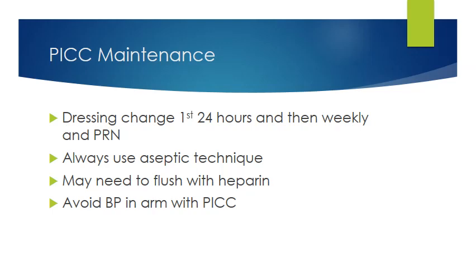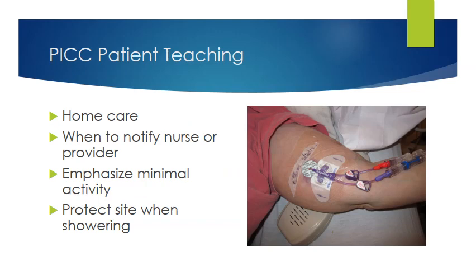If you took a pressure and you had a PICC in there, you have a chance of damaging that PICC line. You could shear it off, and it could go floating wild in the person's bloodstream. So you want to make sure that you're watching that. All right, so what do we need to do as far as patient teaching?